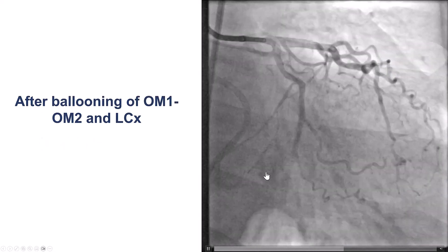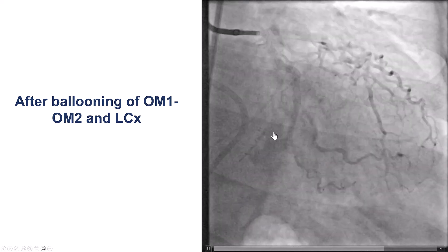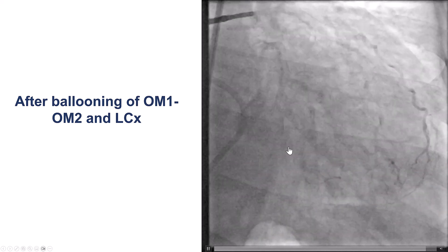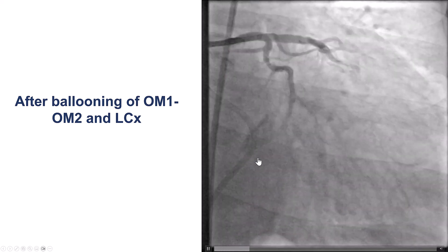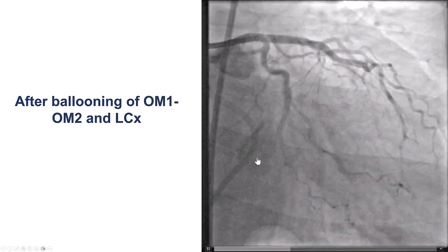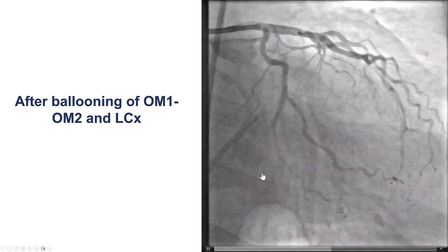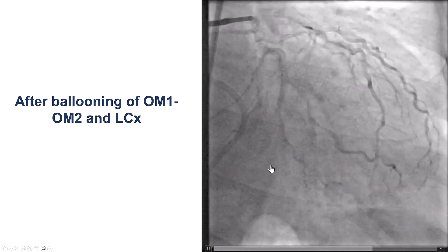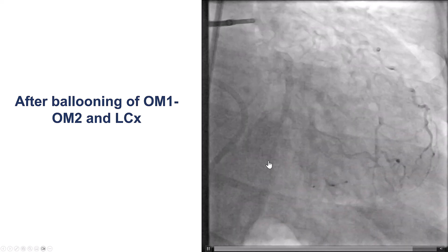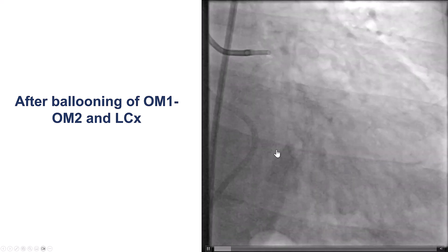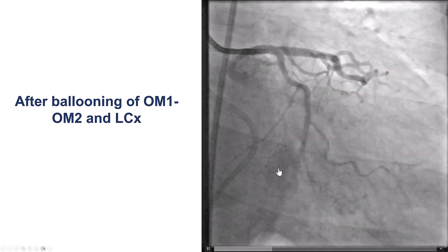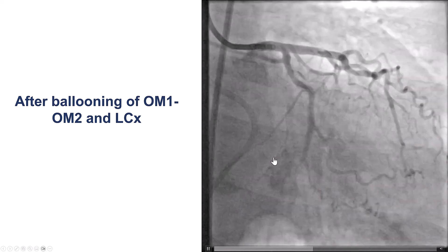However, the contrast did not go away. The stain stayed in the same place, which was reassuring that we don't have a free-flowing perforation that can lead to tamponade.